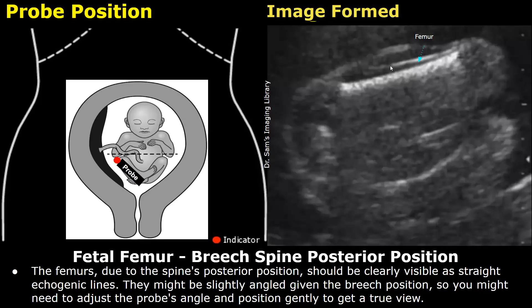This is the femur in the near field, and this is the other femur in the far field. We do not see it very clearly because the near femur is casting posterior acoustic shadowing, which is affecting the visualization of the far-field femur.